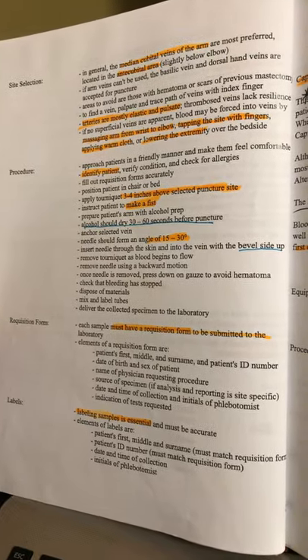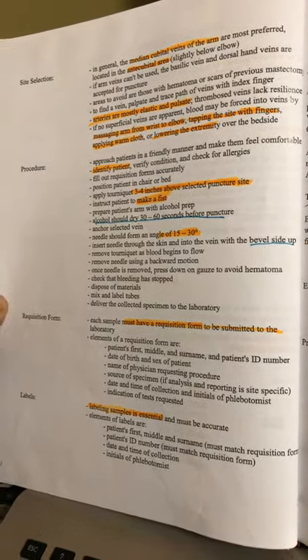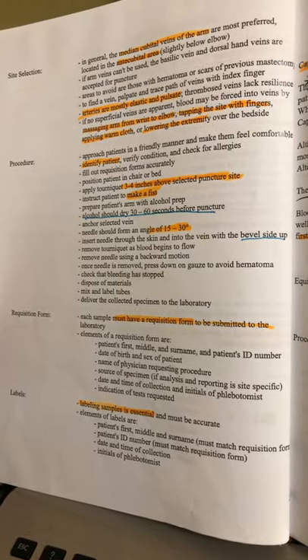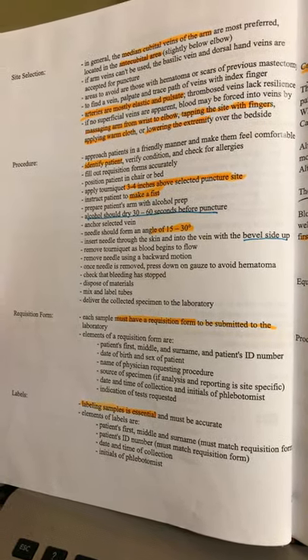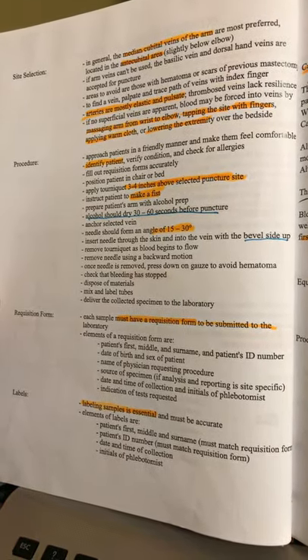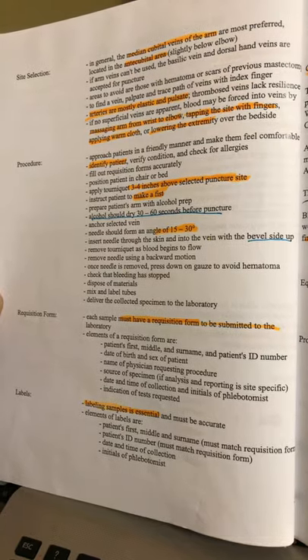Approach your patients in a friendly manner and make them feel comfortable. Identify your patient. Make sure you apply your tourniquet three to four inches above the selected site. Make sure you ask them to make a fist.